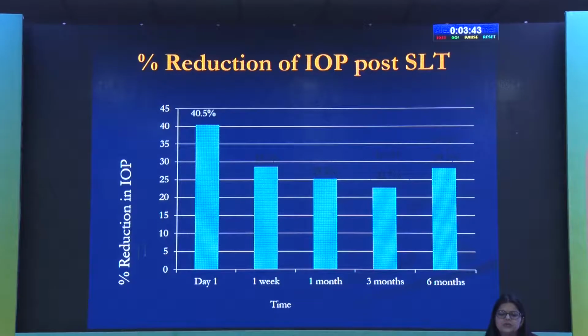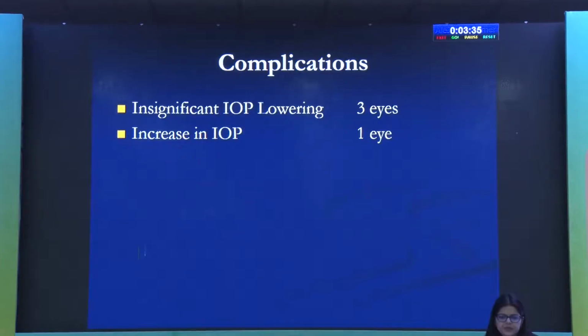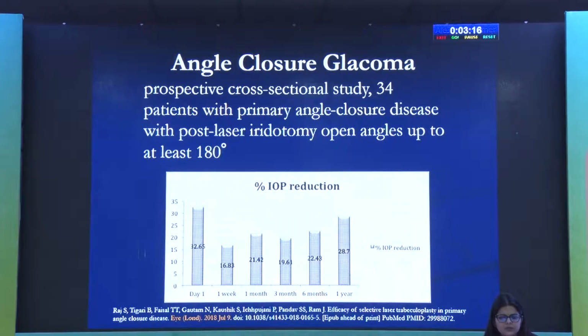And you can see in this study, we had a significant IOP reduction at all time points, at least up to 6 months to 1 year. We didn't have any complications here. 3 patients didn't respond; the SLT didn't reduce IOP in these patients. In one patient, paradoxically, the IOP actually went up after SLT. Apart from that, we didn't have any complications during this period of time.